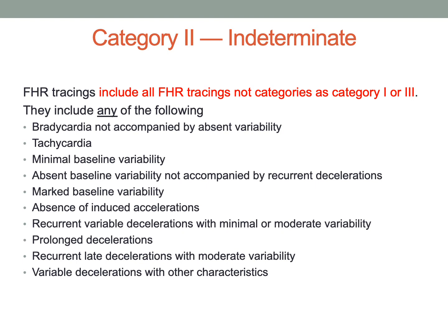Category 2, or indeterminate. These are the ones that you have to intervene on so that it does not become a category 3.